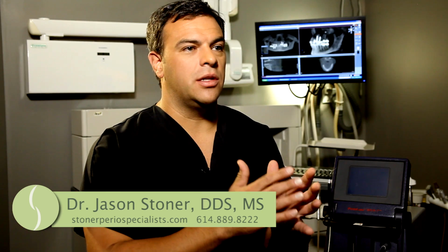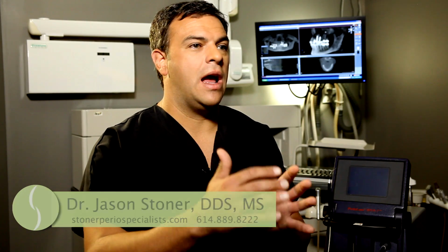Then we can do a cleaning of the root, and we come back with a laser in a second phase, all in the same appointment, where we create a blood clot between the gum and the tooth, the gum that is now eradicated from the diseased tissue and bacteria. That clot brings in stem cells that regenerate the tissues necessary to give you structure back for your tooth, those being the gum, the bone, and the periodontal ligament.